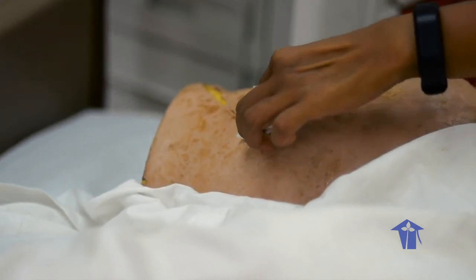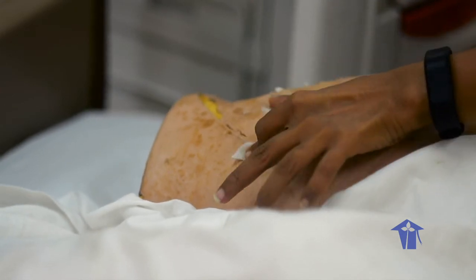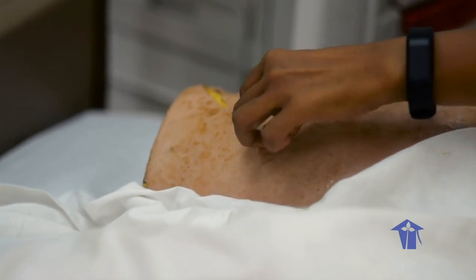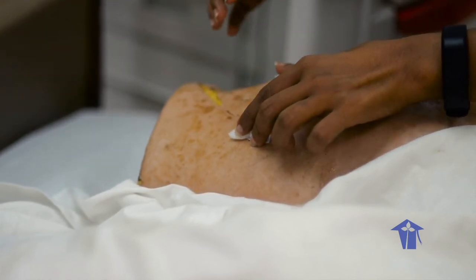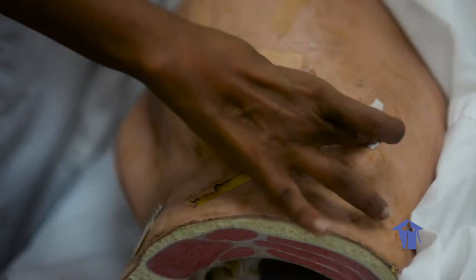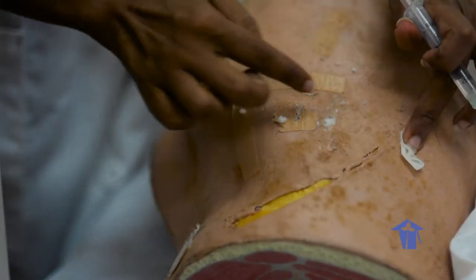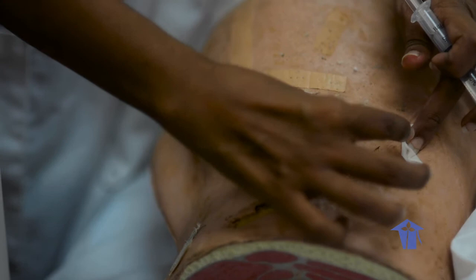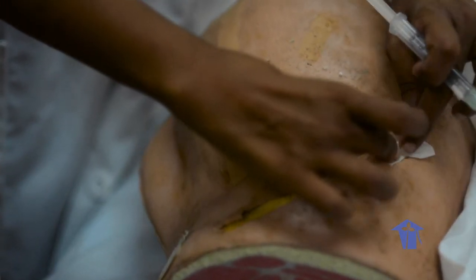Displace the skin by pulling the skin down or to one side about 1 inch, 2.5 centimeters with your non-dominant hand and hold the skin tissue in this position. Identify the upper outer quadrant of the gluteal muscle. Right, upper outer. I'm using this piece of swab as a direction.